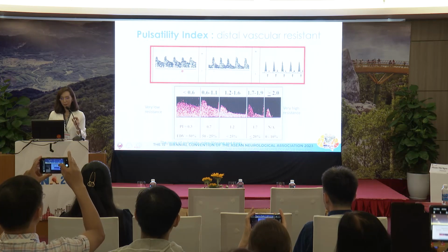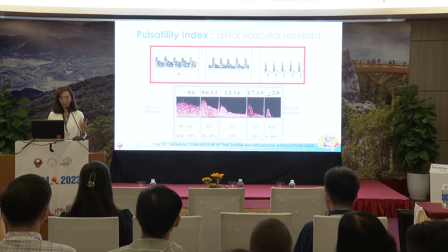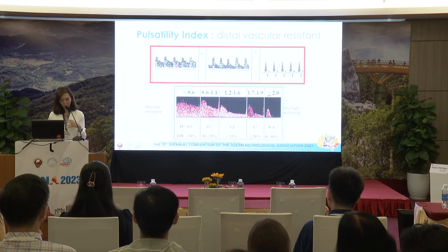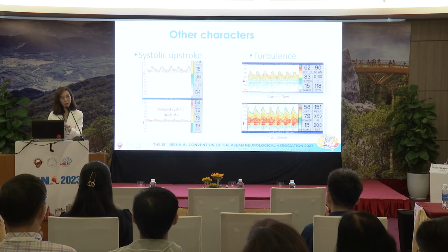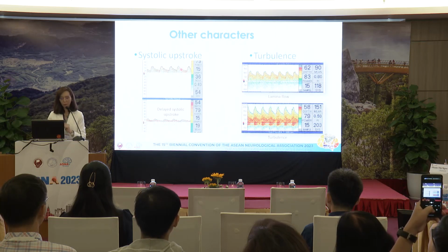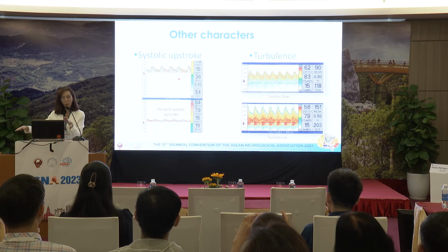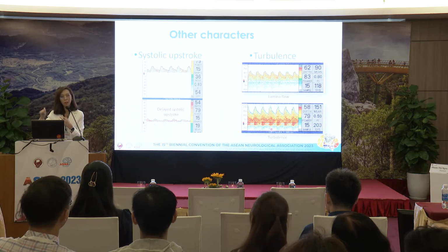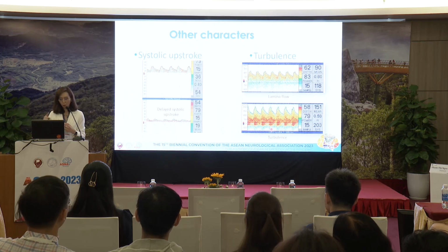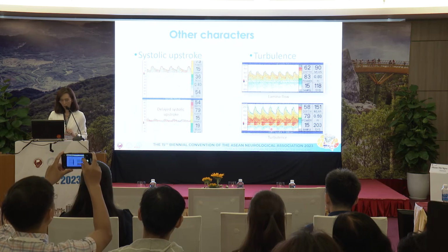So for intracranial vessels, we are looking at the low resistance circulation. So it's very likely that it's going to be in this range, and it usually looks like this for the intracranial vessels. There are some other characteristics that you have to look at in the waveform, the systolic upstroke. Sometimes you have a dampened waveform, meaning that you are at the distal part of the stenosis. Or sometimes there's some turbulence. When there's a stenosis, there's turbulent flow, so you can hear the murmur or some turbulence noise over the area.